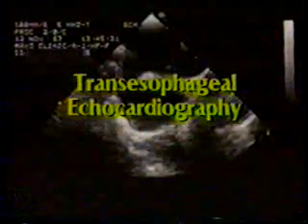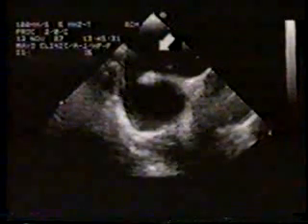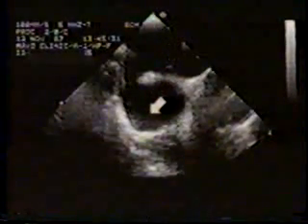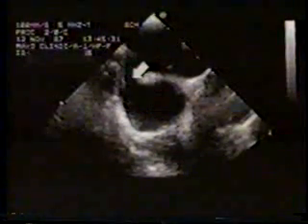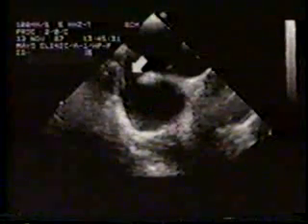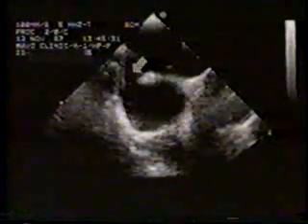This is the transesophageal echocardiographic examination of another patient, age 57 years. We are looking at the left atrium, atrial septum, and right atrium. Note this patient has sinus venosus ASD, which is clearly visualized on this examination, while this defect could not be visualized from the standard precordial and subcostal examinations. You can visualize this defect in real time now.